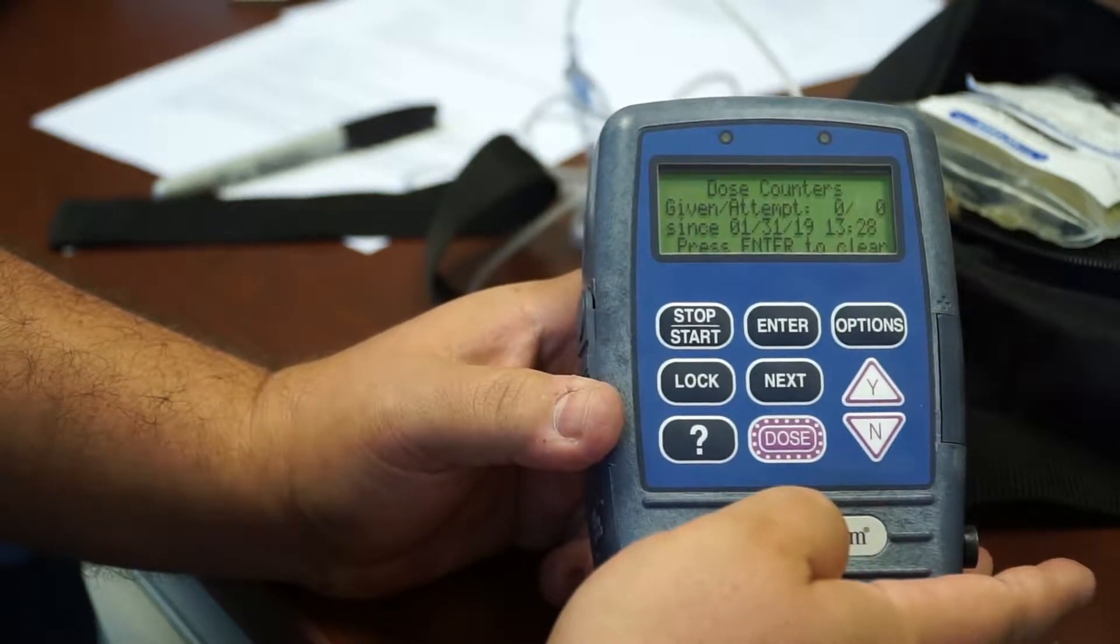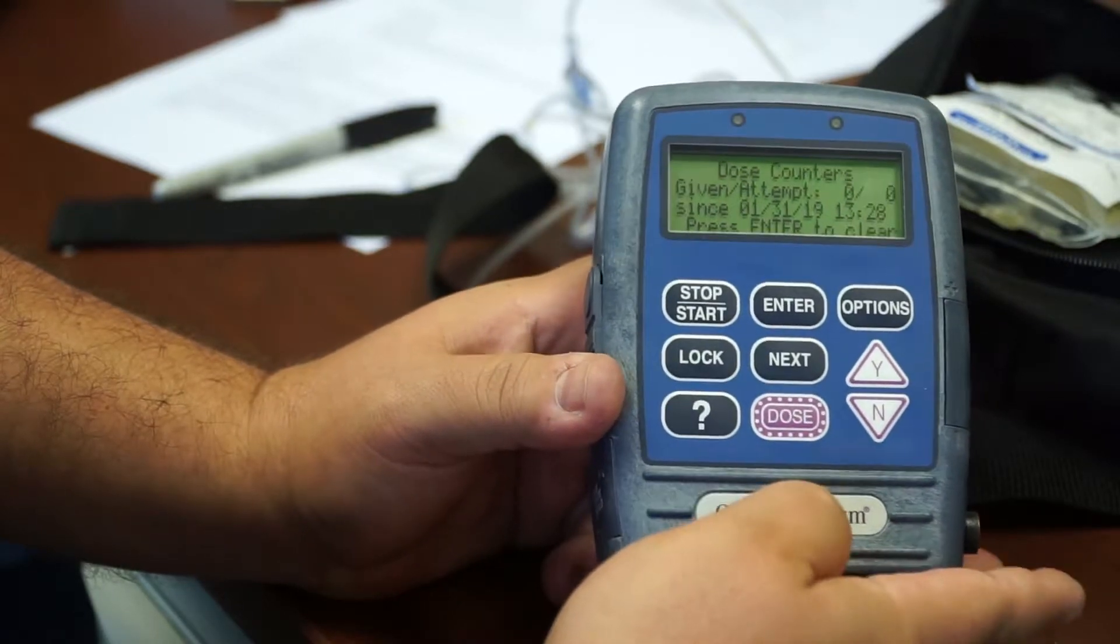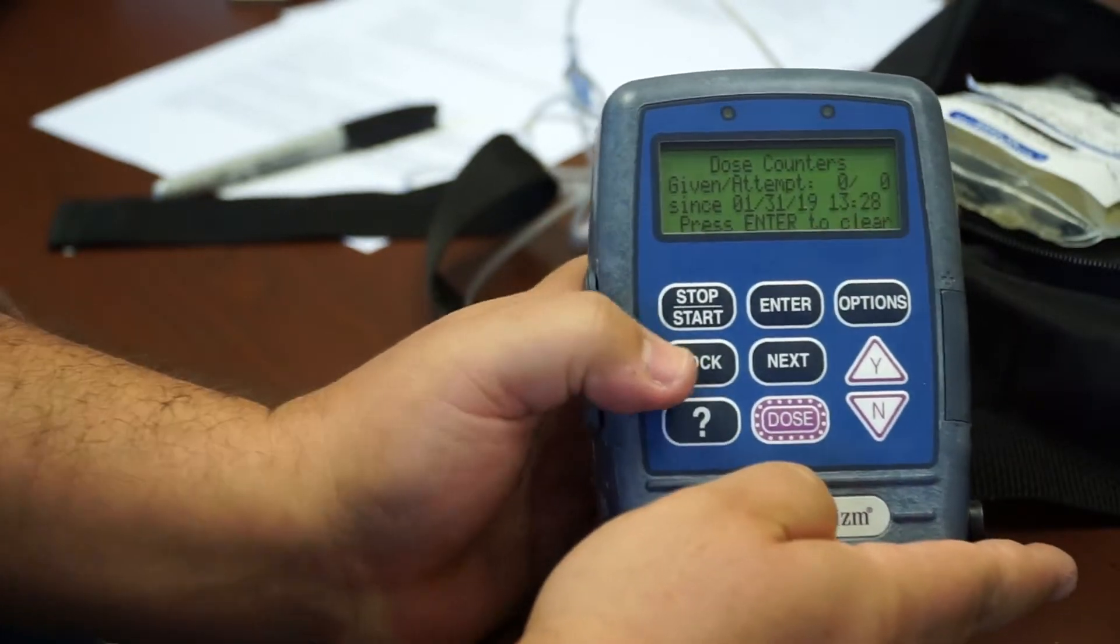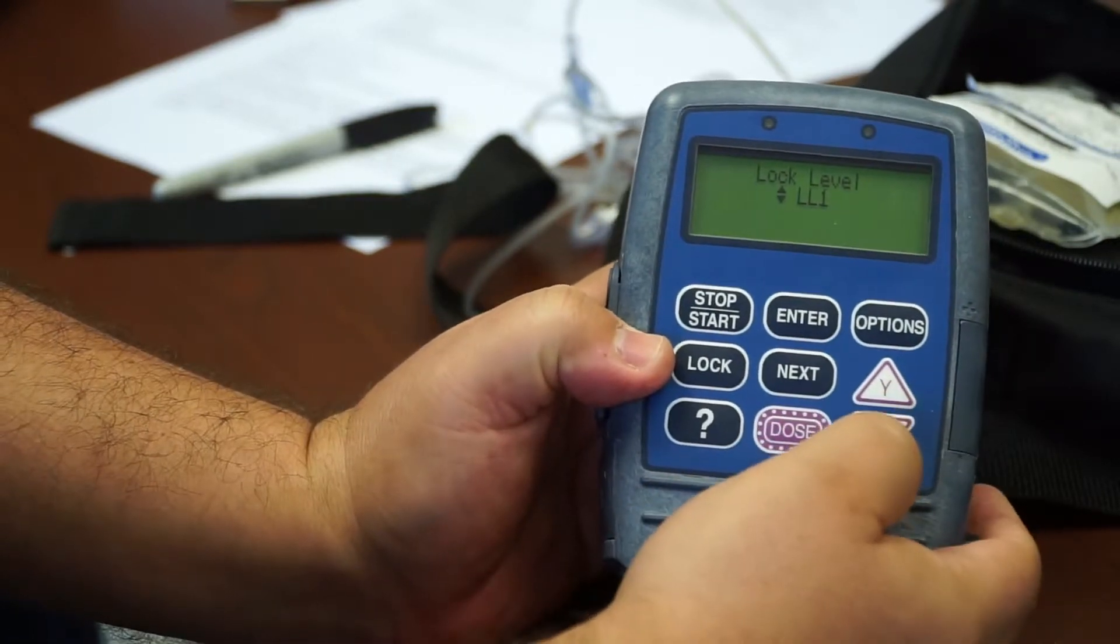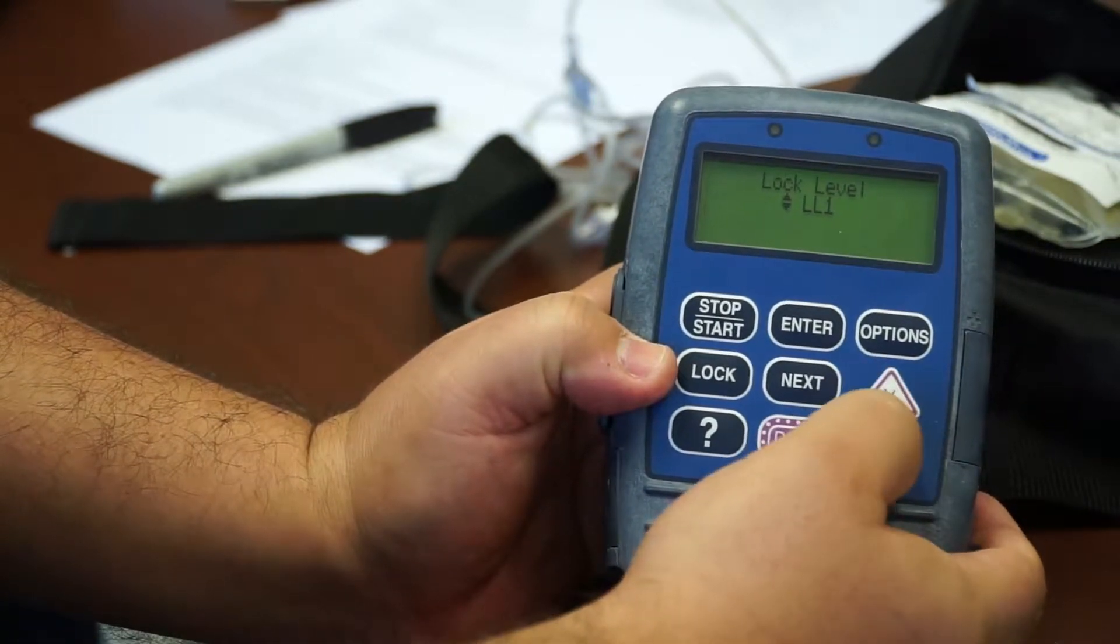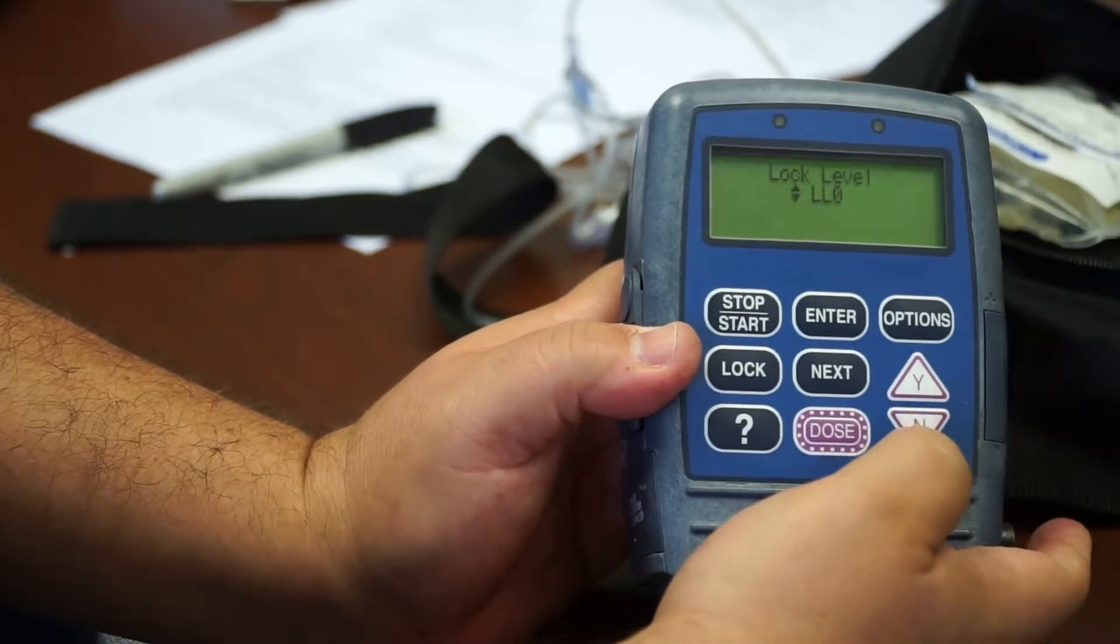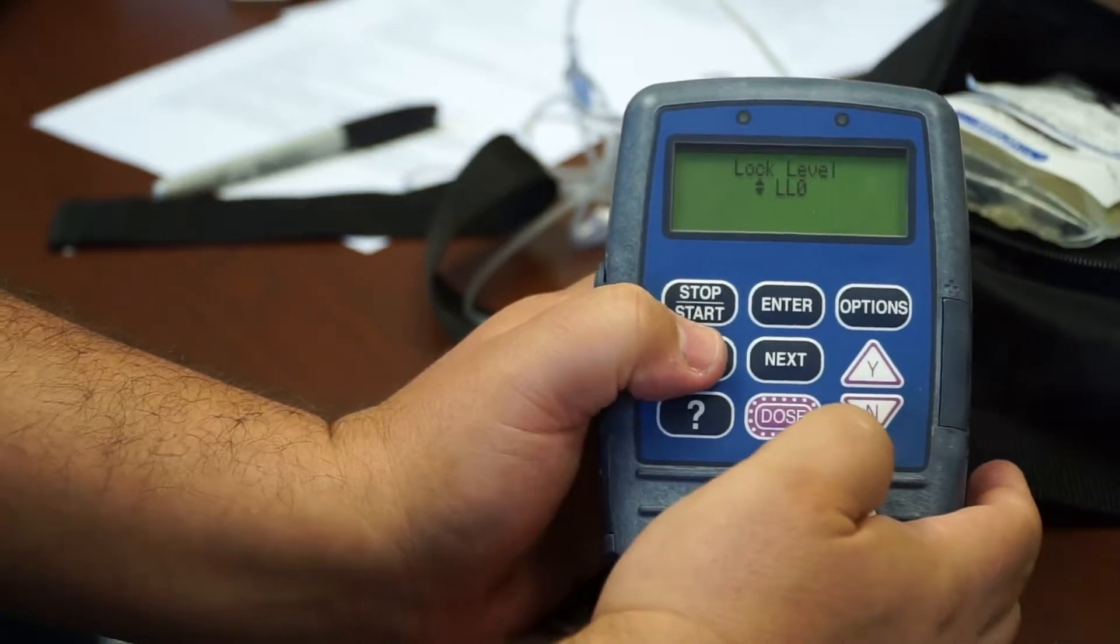The way that we do that is by first changing the lock level. In order to change the lock level, we press on lock. We switch the lock level to zero by pressing the down arrow, and then we press lock again.